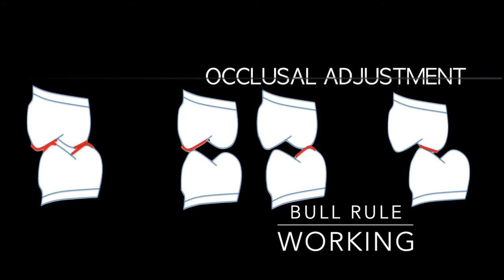In that, you are adjusting following the BULL rule. B is buccal upper and LL is lower lingual. So the lower lingual cusp is the one you are adjusting. When you check, you will have a mark on the upper cusp and lower cusp, where both sides are marked by the articulating paper.